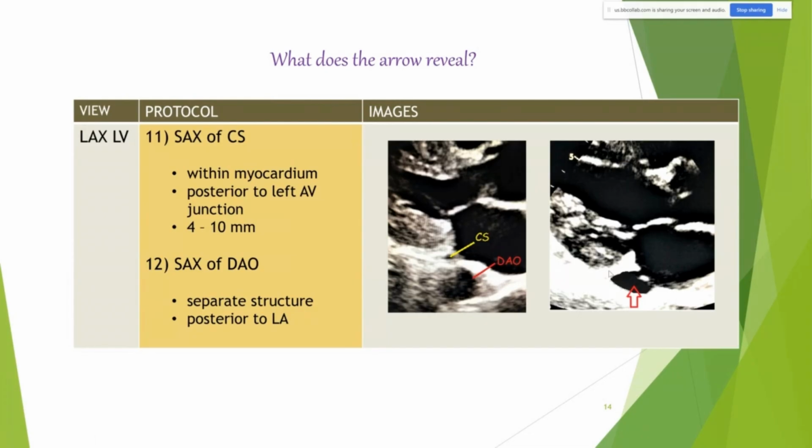We'll talk about that much later. But it's a common variant where the superior vena cava drains into the coronary sinus behind the left atrium, which causes the coronary sinus to become dilated. So then the coronary sinus is now going to drain directly into the right atrium. This is why they won't worry about it. It won't cause any problems. It just means that the person is going to have that dilated coronary sinus.